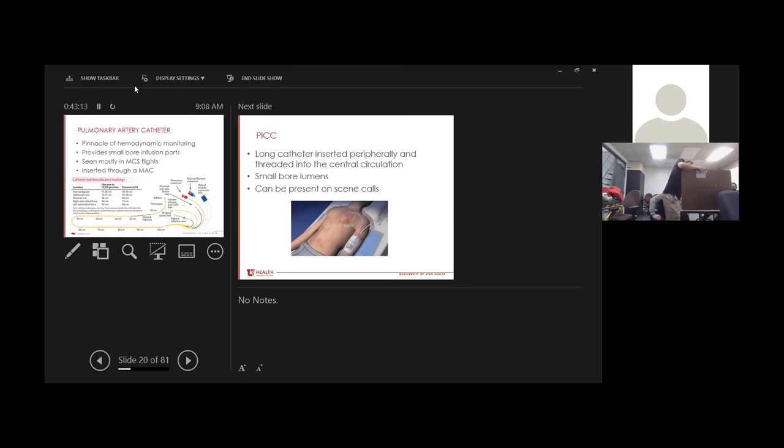To a cardiac monitor, which we're not going to have to use today, but when you go to the ICU next two weeks, they're going to talk to you about that. And then you've got the port you want to transfuse. Okay.